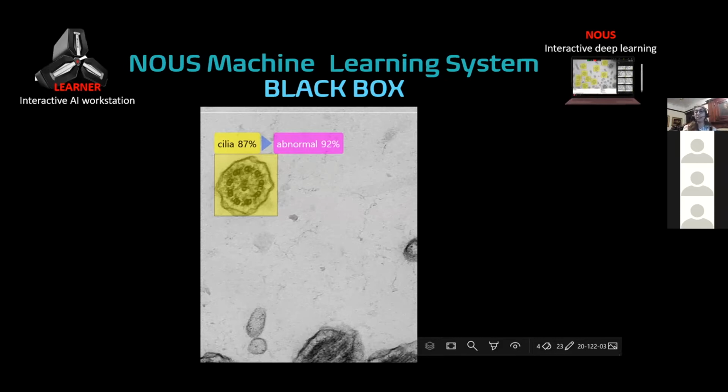It's basically a tool that we turn on and we have a small heat map that appears around something, and we know that at least that's where the system is putting its attention, it's focusing on that. So if you have that little writing with the patient details, that's easy to catch and see that it's just not going in the right direction. So the attention map is really good to have a sneak peek inside the black box.